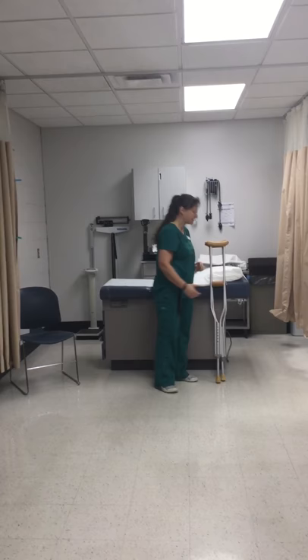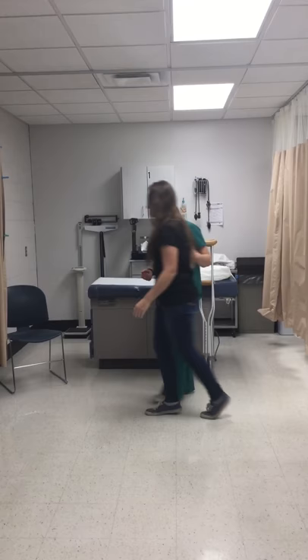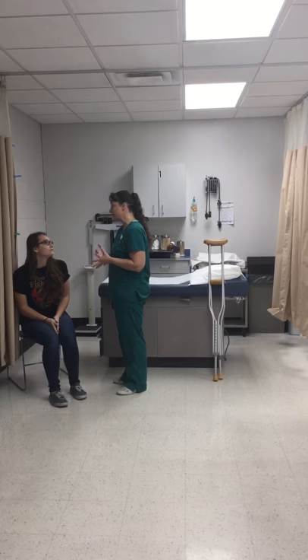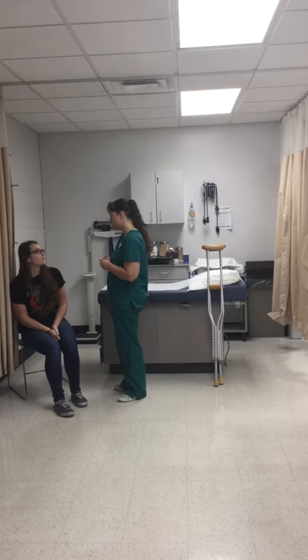Step two says to identify the patient and explain the procedure. I'm going to call my patient in — Erin Woods. Hey Erin, how are you? I'm going to have you have a seat here. Your ankle bothering you? What we're going to do today is get some crutches fit for you to help you get around with that ankle. Can I get your birthday before we get started? April 10th, '03. Okay, perfect — that's what I have in your chart. So next I'm going to have you stand up so I can adjust these for your height.